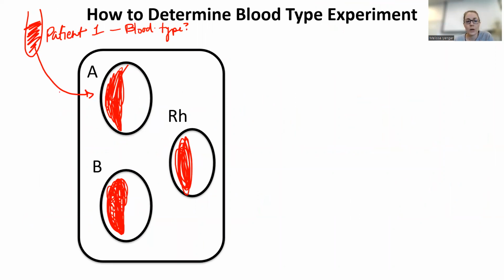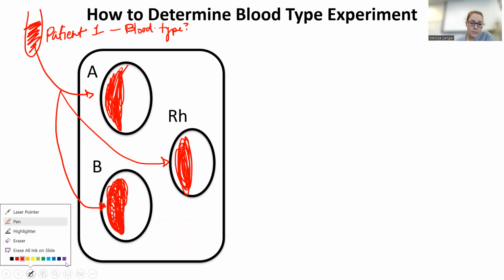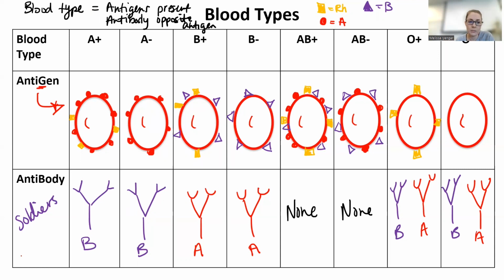So what I'm going to do is take 1 to 2 drops of blood, mostly 1 drop of blood, and put it in my little well. Oh, I did this kind of bad. I'm going to change my red color here. I should have realized that. Sorry.